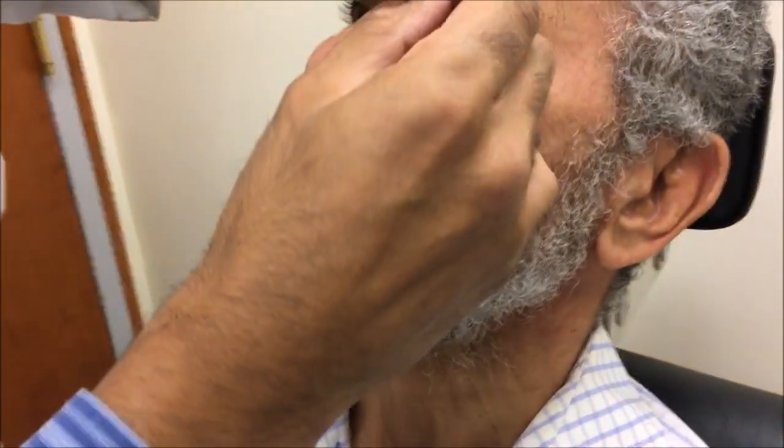The graft is already on. I'm just going to smooth it out a little bit. Now I'm putting a two-dimensional flat object on a 3D curved cornea, so of course there's going to be some wrinkles, but as you can see it's really pretty clear except for the periphery.